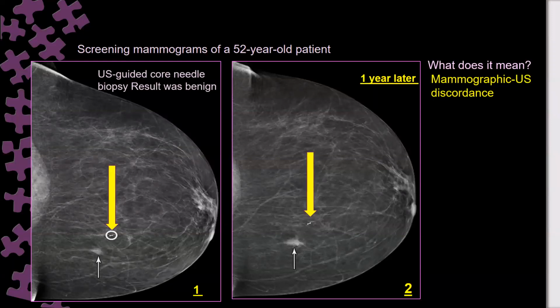Okay, and this is the breast. Can you see it here? Far away from the site of the lesion is where they had taken the biopsy. They had taken the biopsy from this area where the tissue marker is. So it is obviously the tissue marker in the wrong place, not at the same location of the real lesion.